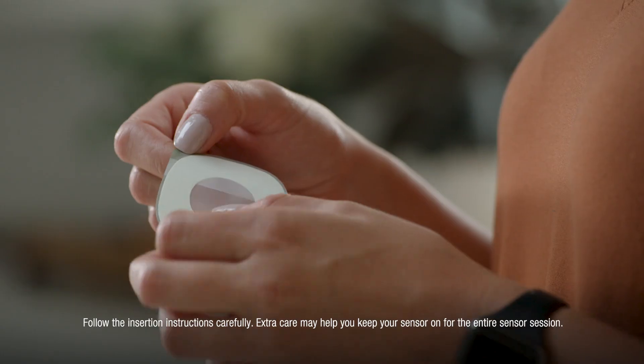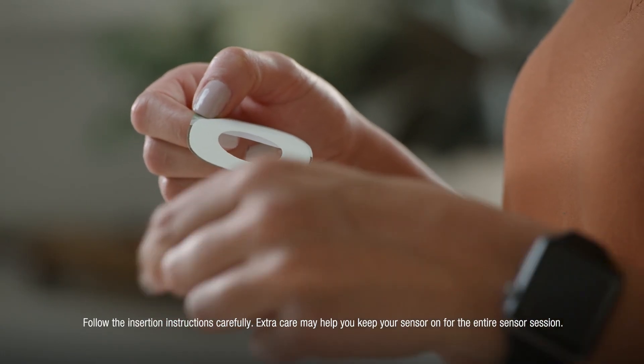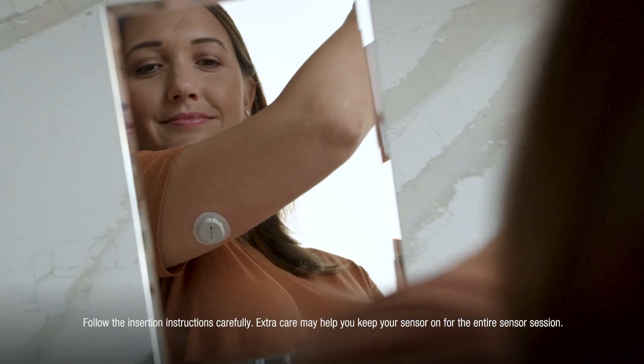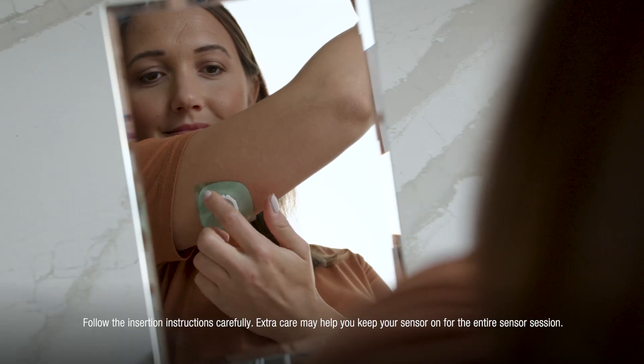Carefully pull off the clear liners one at a time. Don't touch the adhesive area. Use the tab to place the overpatch around the sensor. You may need to look in the mirror for this part.